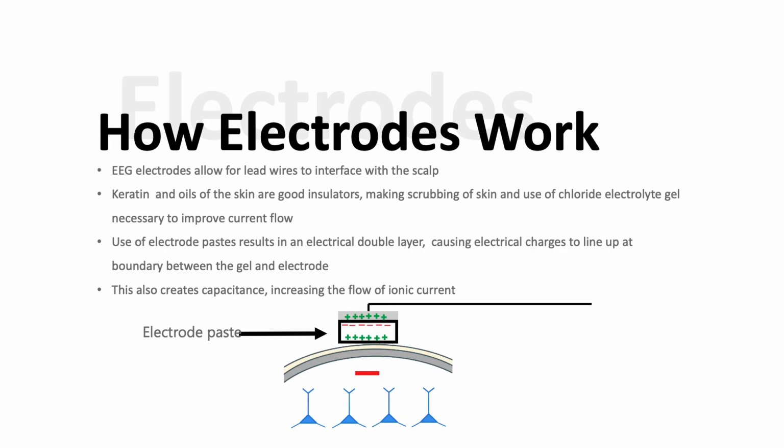You may wonder how electrodes work and how they actually do this. The EEG measures electric potential differences between two electrodes over time, which is reported as fluctuating voltage over time. With that in mind, you may wonder how an EEG actually records local electric potentials with electrodes.